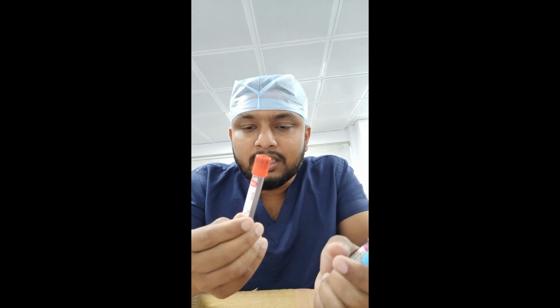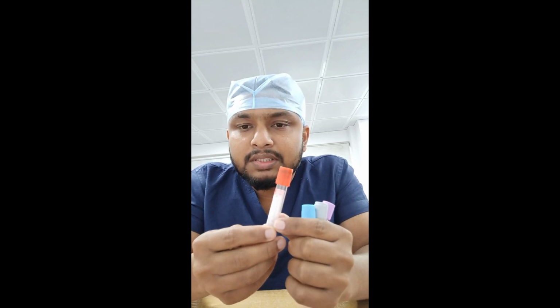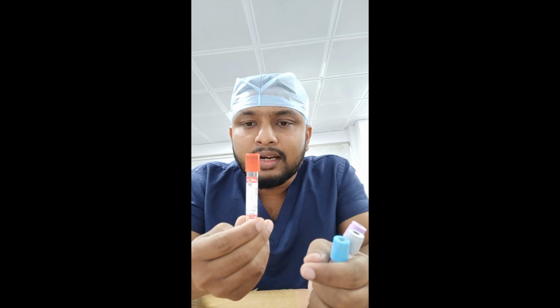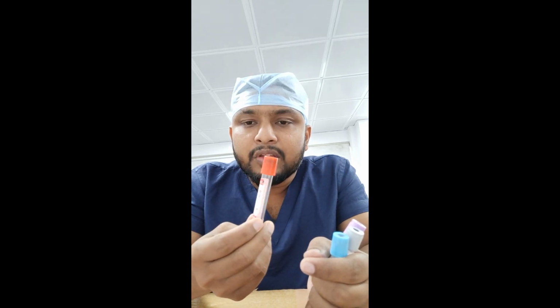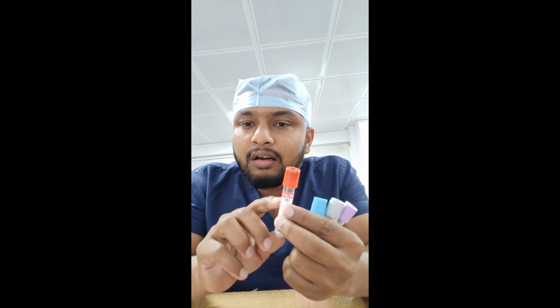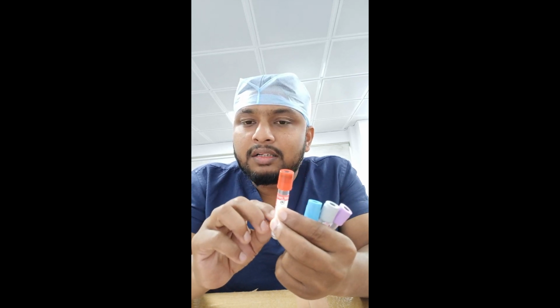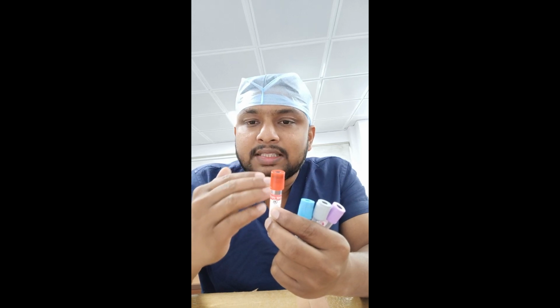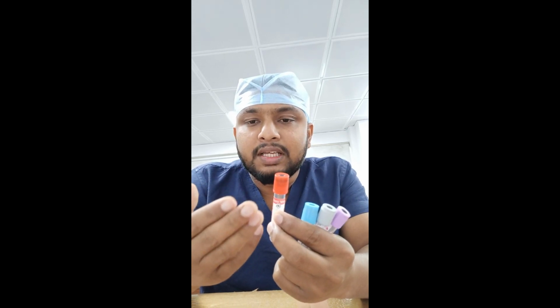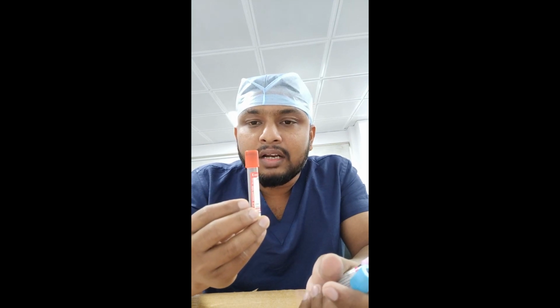First we will see the plain container. This is very, very important. For most types of biochemistry lab tests you will use this red color tube and send it to biochemistry. Mainly the blood will clot in this type of container. After clotting, on top you will see the serum. Biochemistry tests require only serum. All types of serological tests will be done in the biochemistry laboratory, so that requires a red Vaccutainer.